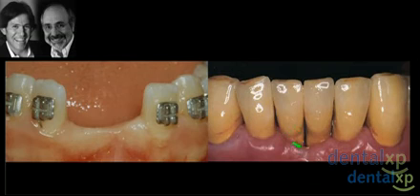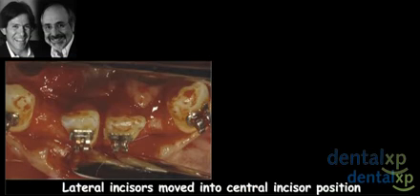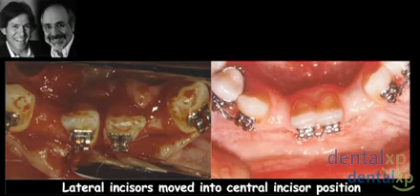Absolutely. I think that we have to be concerned not only with aesthetics, but long-term maintenance of this very, very critical seam. So for our group, obviously, we do concern ourselves with aesthetics, and we do want the goal of therapy to be to reconstitute the lost vertical and horizontal component of the ridge, but we want to do so in a way that would give us the best opportunity to do this, not only for the aesthetics, but also for long-term management of this periodontally.